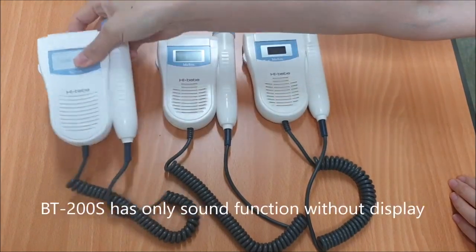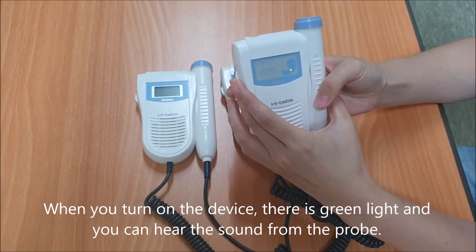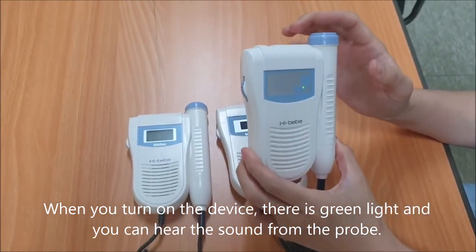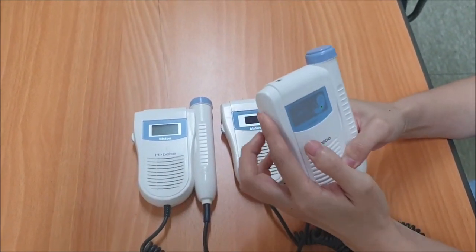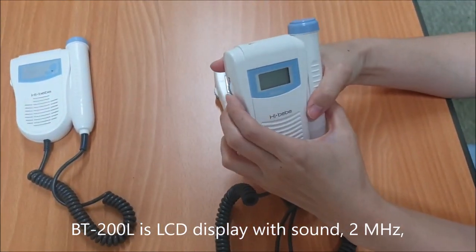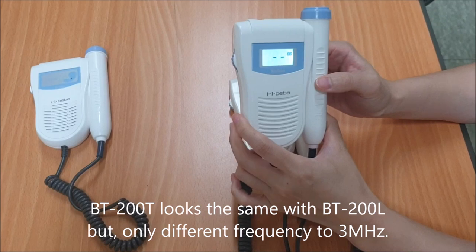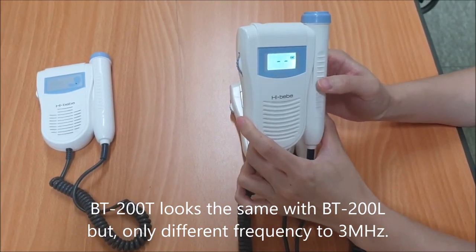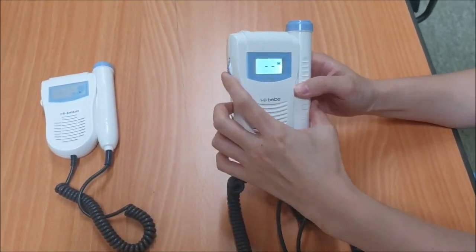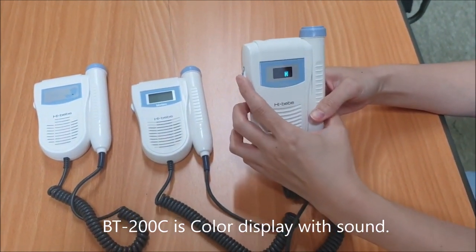BT-200S has only a sound function without a display. When you turn on the device, there is a green light and you can hear the sound from the speaker. BT-200L is an LCD display with sound and is 2MHz. BT-200T looks the same as BT-200L but with a different frequency of 3MHz. BT-200C is a color display with sound.